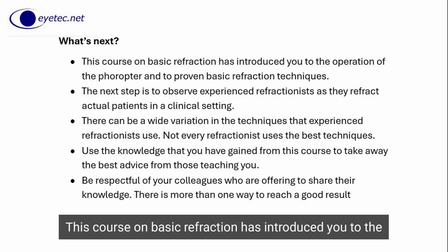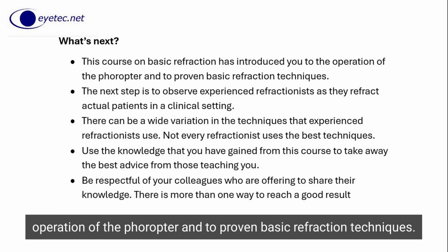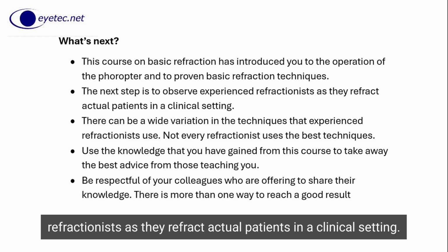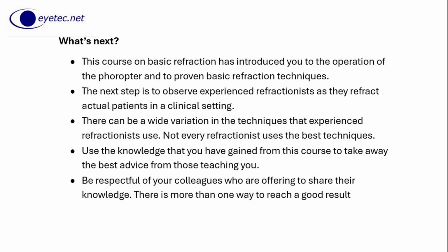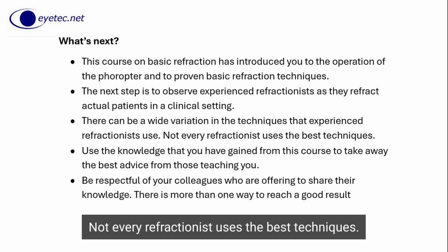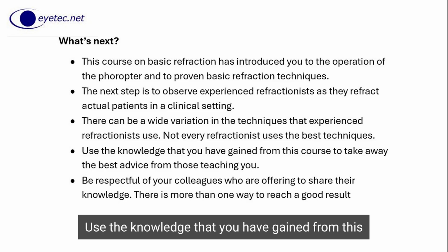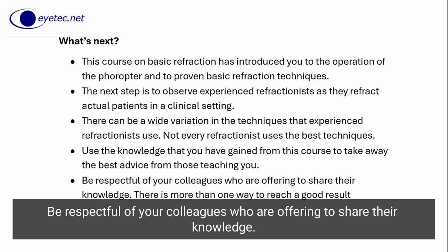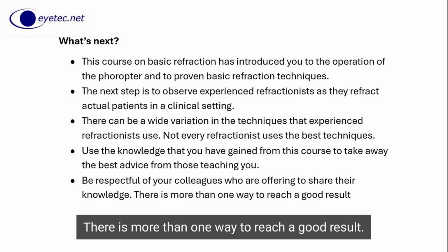This course on basic refraction has introduced you to the operation of the phoropter and to proven basic refraction techniques. The next step is to observe experienced refractionists as they refract actual patients in a clinical setting. There can be a wide variation in the techniques that experienced refractionists use. Not every refractionist uses the best techniques. Use the knowledge that you have gained from this course to take away the best advice from those teaching you. Be respectful of your colleagues who are offering to share their knowledge. There is more than one way to reach a good result.